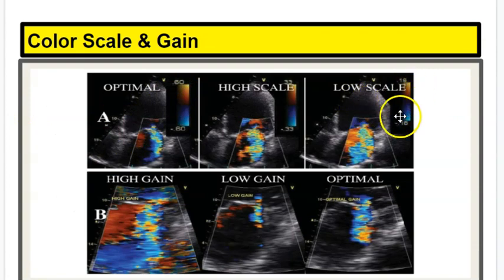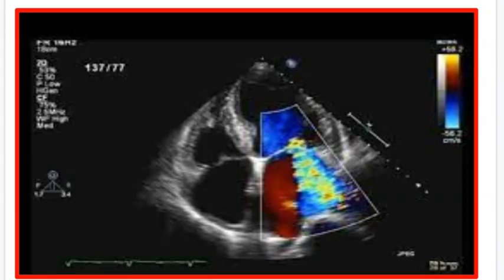So that's our scale rate. You can see our scale over here in the right hand corner. We talked about the blood velocity scale over there in class. And here's our scale over here, and we see our centimeter scale over here. Looks like it's around, I can't see that, 56 maybe.